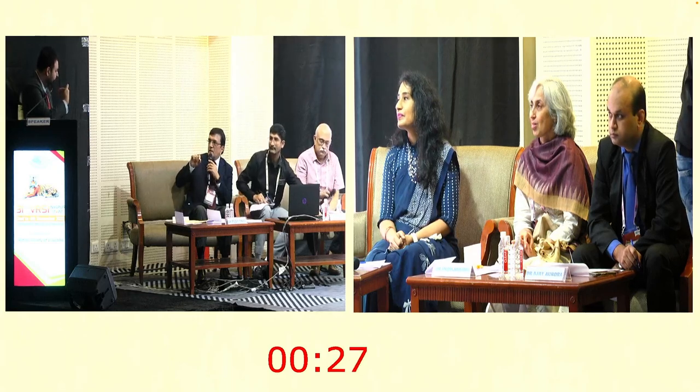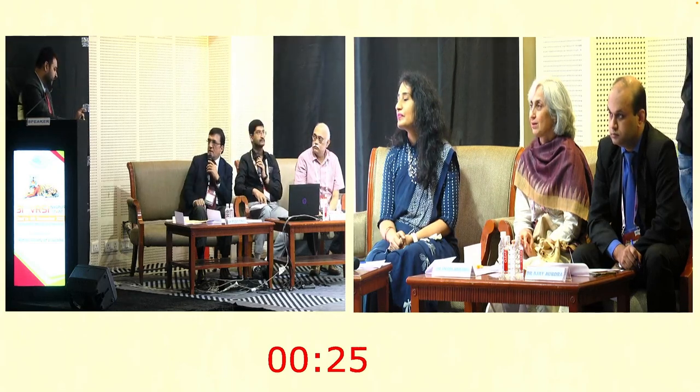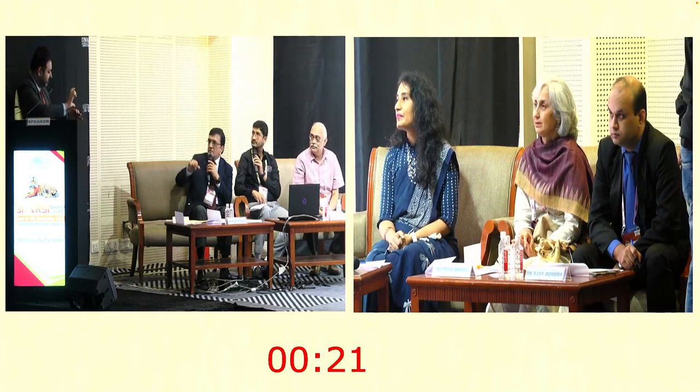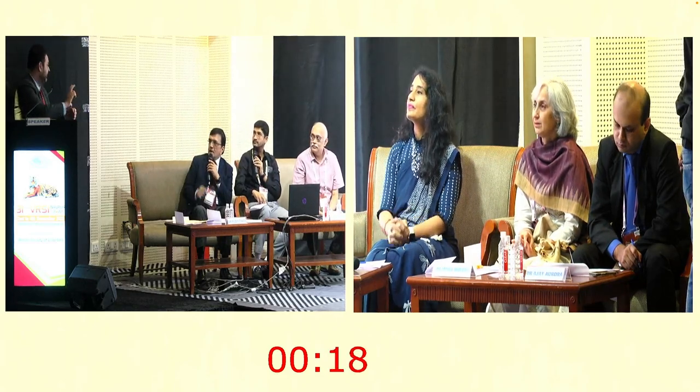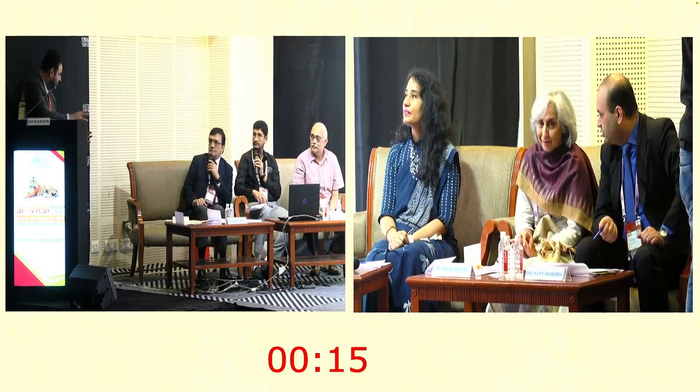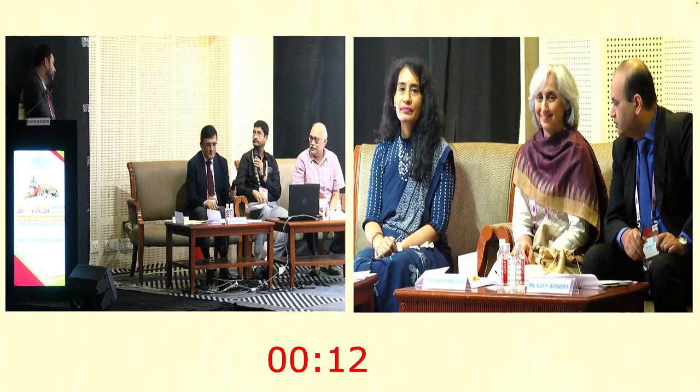What is your endpoint? So you say you got a fluid. You can see it, sir, in the syringe filling up. You can see the fluid in the syringe. All that is coming from the subretinal space. Yes, sir. Because you go straight into it, sir.